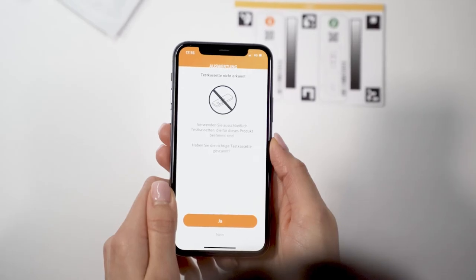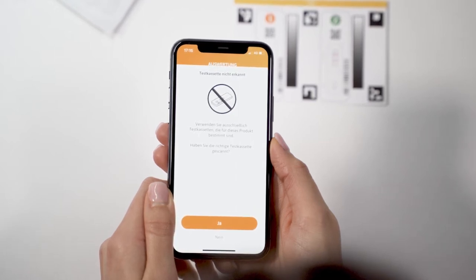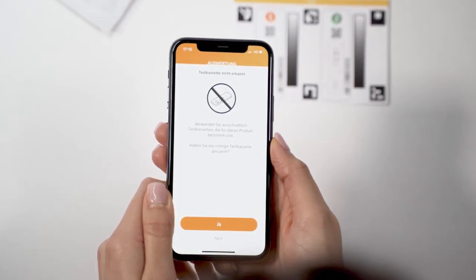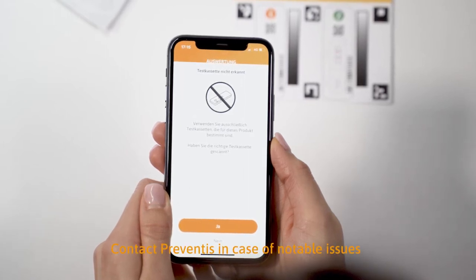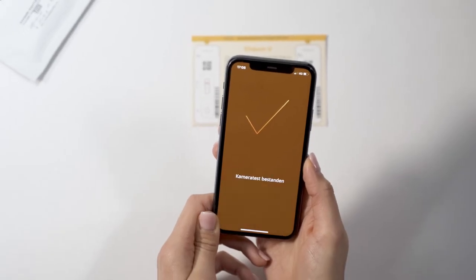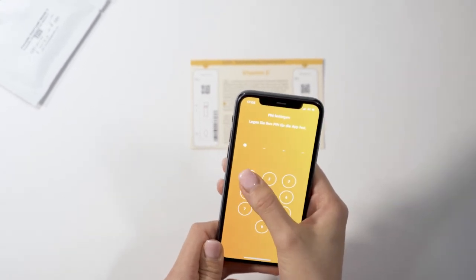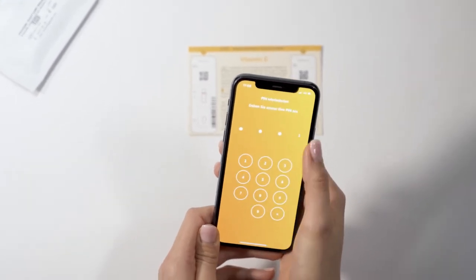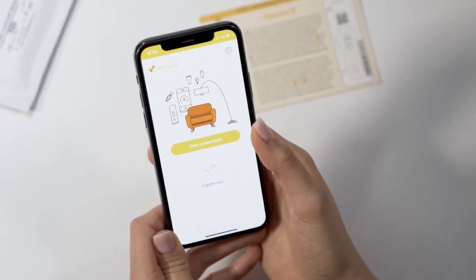If the camera test fails repeatedly, make sure the lighting is even. Check the camera lens for scratches and dirt and remove them if possible. Also check the camera test card for damage. After a successful camera test, set your individual four-digit PIN — this will be requested each time you open the app. Select Prepare Test in the main menu.